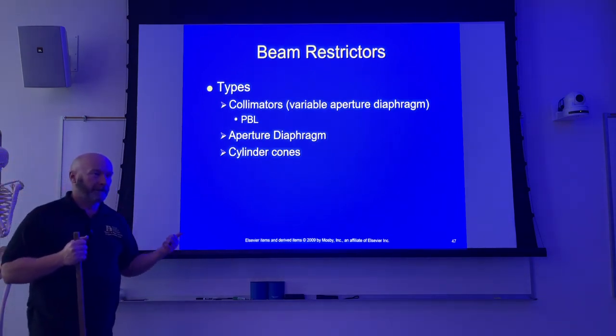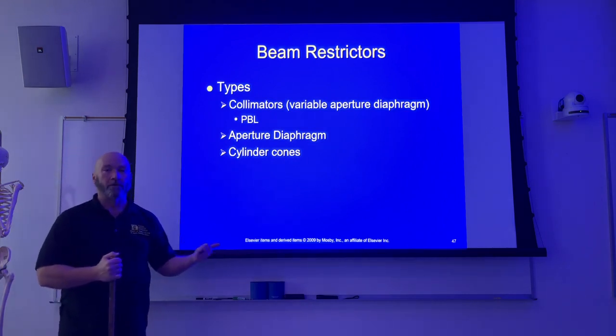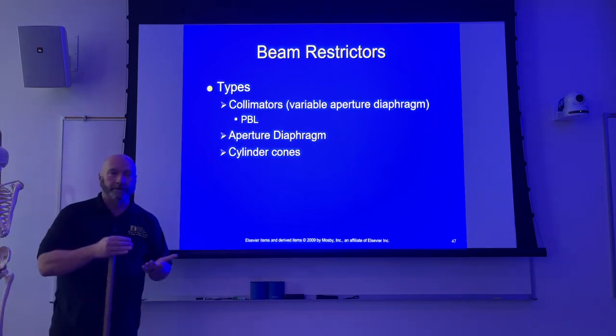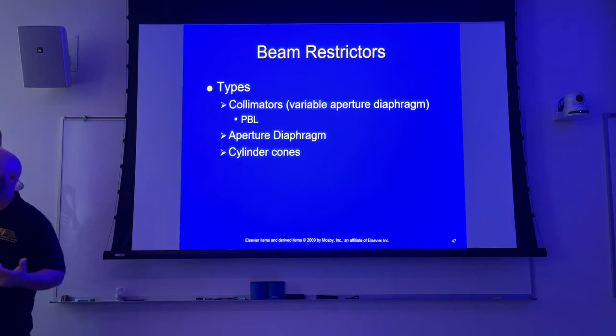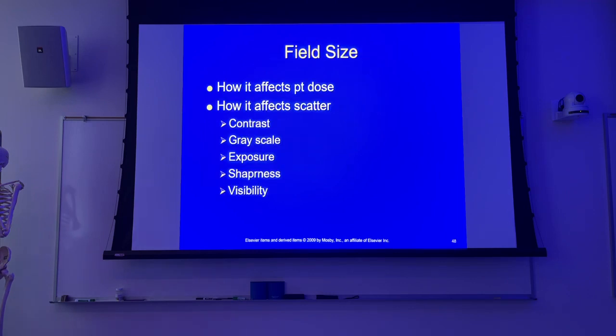But the proper kVp is about making sure you don't create an overabundance of scatter radiation. And the tissue type you couldn't really do anything about without compression. But here, again, we're into scatter creation, making sure that we don't expose too much tissue that would create scatter radiation that would then impact your image receptor.